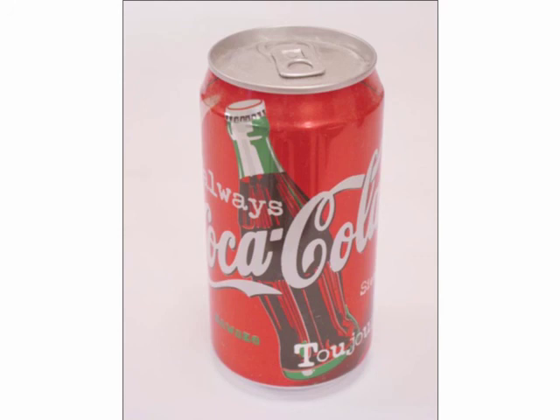So this is a can of soda, and it's a cylinder. And corneas can have cylinder too. Of course, corneas are spherocylinders. They're not just straight cylinders. But we're interested in that portion of the cornea, that part of the curvature, that is a cylinder in an astigmatic cornea. So let me ask you this question. This can of Coke, in the position in which it's sitting here, is with the rule or against the rule?